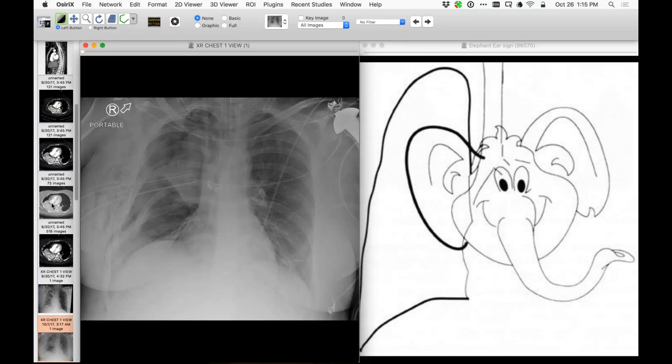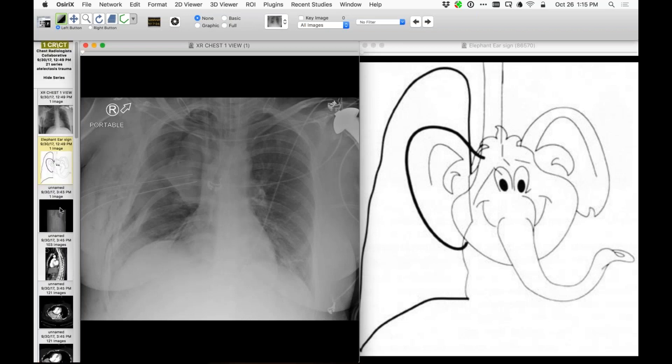I like the elephant ear — that's nice. Because usually, over time, we were describing this as right upper lobe atelectasis, but it isn't. I showed you that the middle lobe is up there.